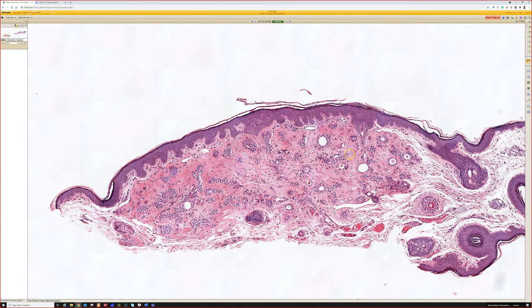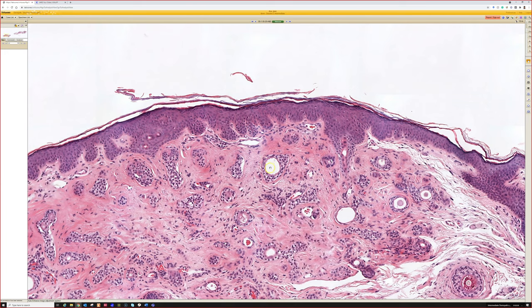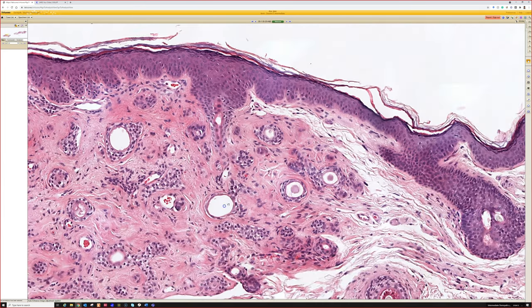Good, syringoma. And so it's made of little ducts and tubules, very obvious gland spaces, right? Like you can see almost every single one. These are cut a little tangential, so you just see kind of the tadpole shape. But usually it is not hard at all to find duct spaces in these, right? Each individual island has a duct in the middle. They're lined by a nice thick pink cuticle. They often have little dried up sweat secretion kind of congealed in the middle there.